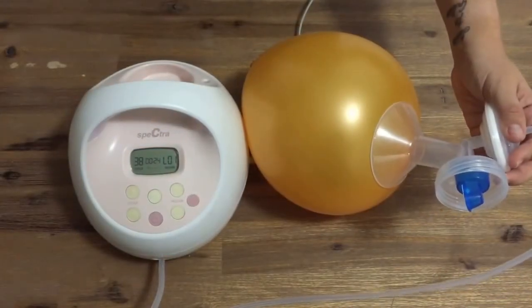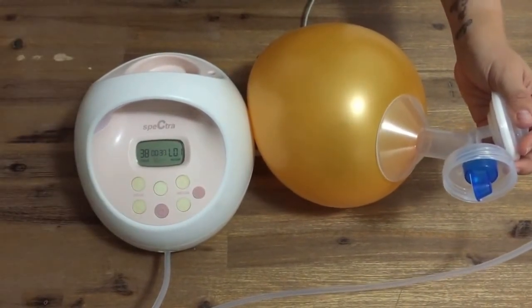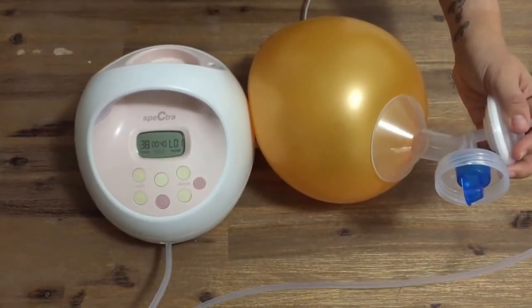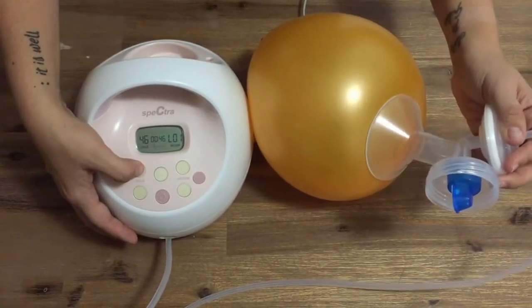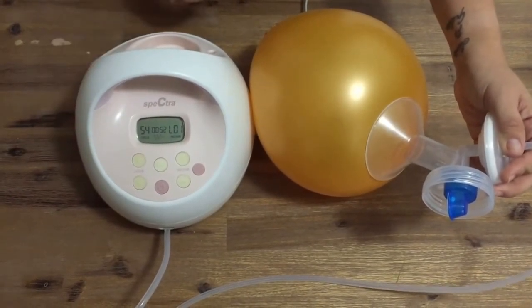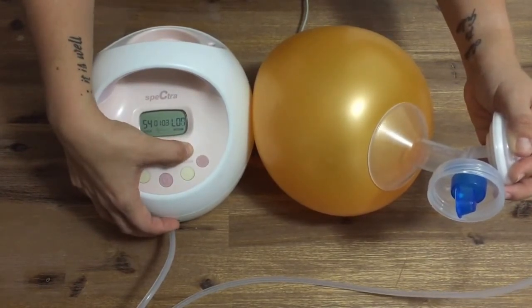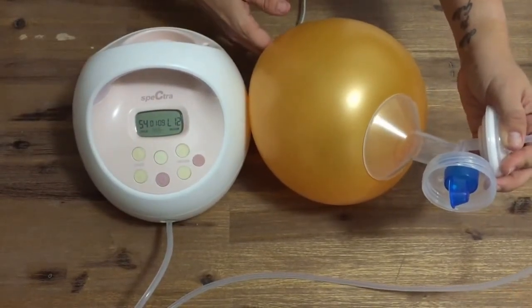The Spectra S2 has different controls for both suction and cycle speed. Here is the pump at its lowest settings: level 38 for cycle speed and level 1 for suction strength. I can change the cycle speed from 38 up to 54 and increase the suction strength up to level 12. Here it is on level 6 and at its strongest at level 12.